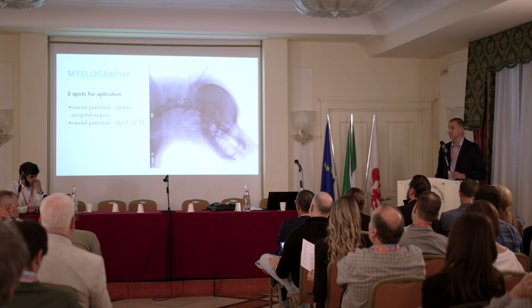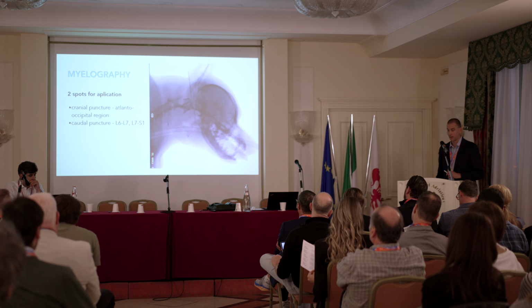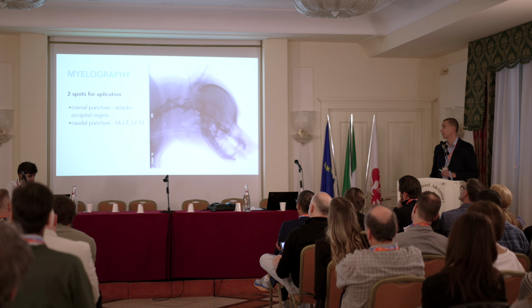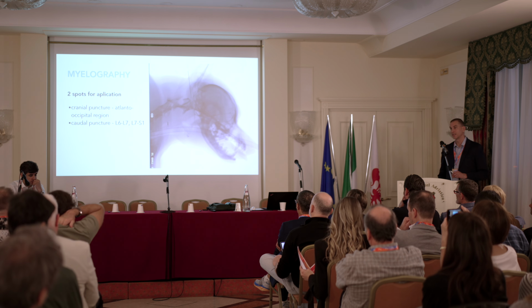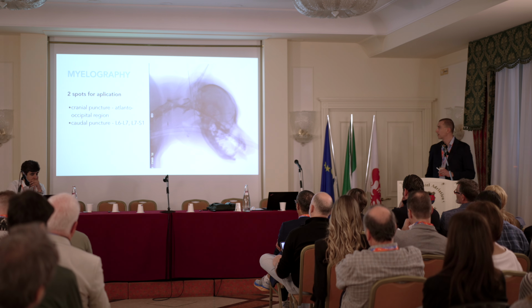So, as I said, there are two spots of application. The first one is cranial puncture. We use the atlanto-occipital region, and the second is caudal. And caudal puncture is L6-L7 or L7-S1.